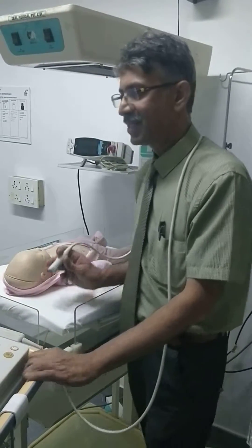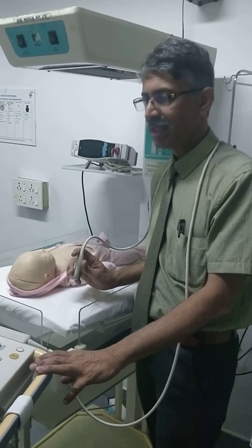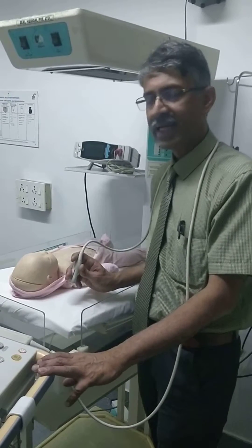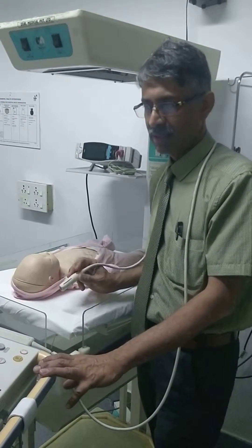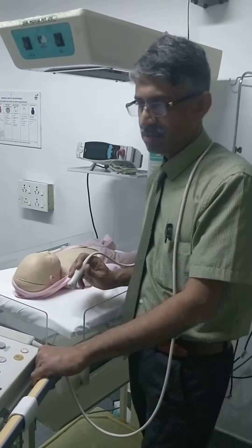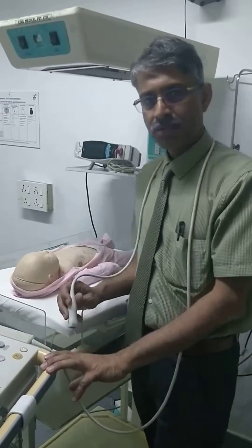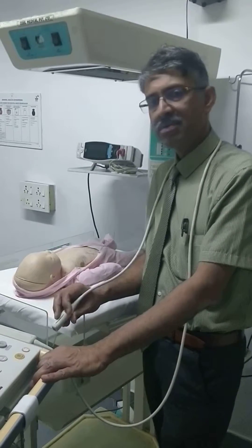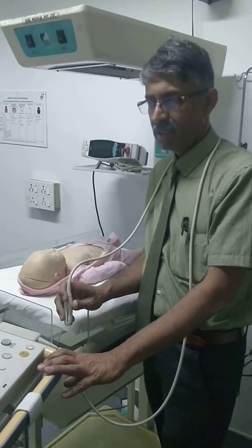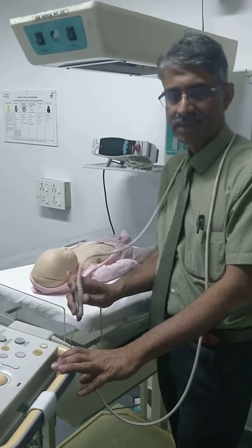I am Dr. Venkate, a consultant implantologist. Today I am teaching the segmental approach of the heart using bedside echocardiography. Three important approaches we always follow to define the segmental approach: venoatrial, atrioventricular, and ventricular arterial.